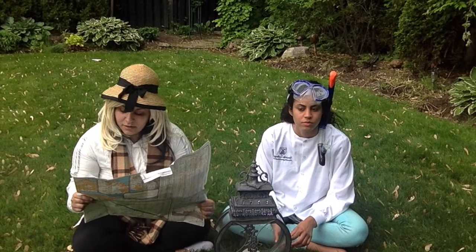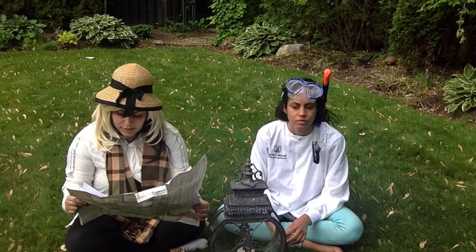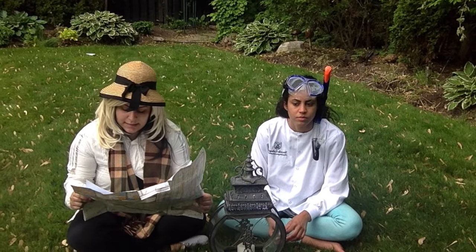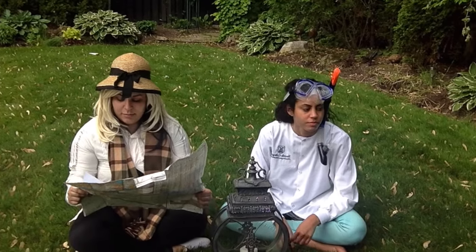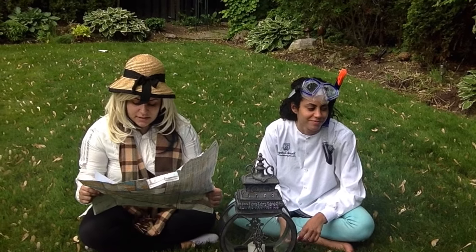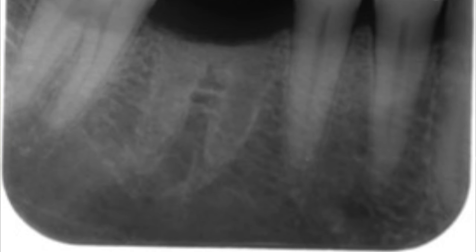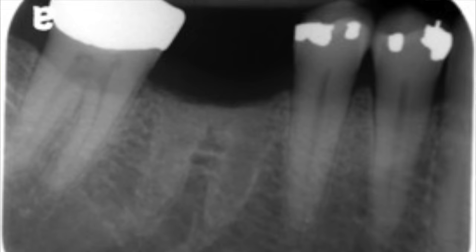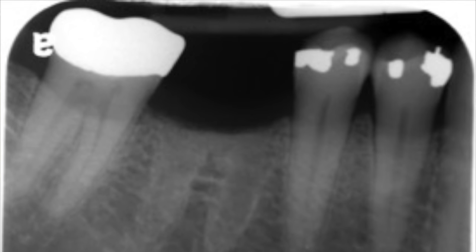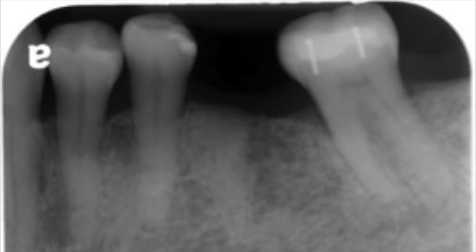The last condition is the sclerotic bone, which is also called osteosclerosis. It is a pronounced focal radiopacity, usually seen below the roots. The cause of this condition is unknown and inflammation is not connected with the condition. Usually it is found near the tooth and it can be all types and sizes and shapes. The margins are smooth or irregular and they can be anywhere within a mouth.